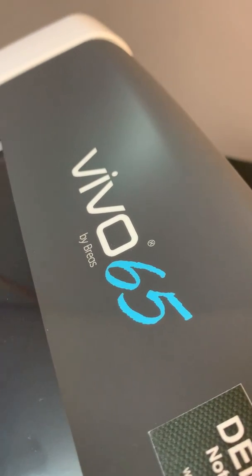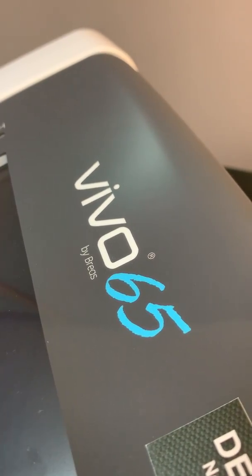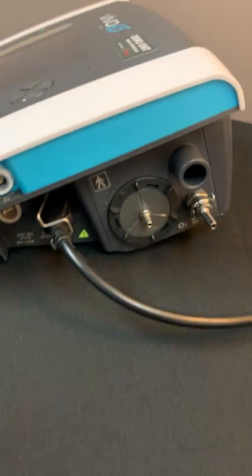Hello, my name is Michael Griggs. I'm the Director of Clinical Services for Breas. Over the next couple of minutes I'm going to go over the right panel of the Vivo 65.